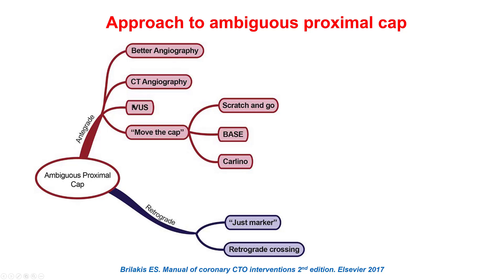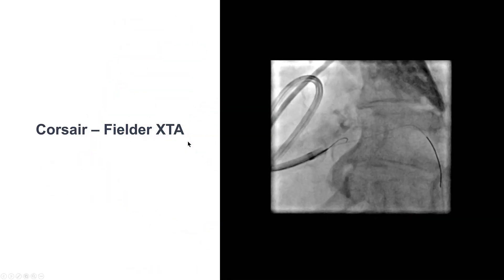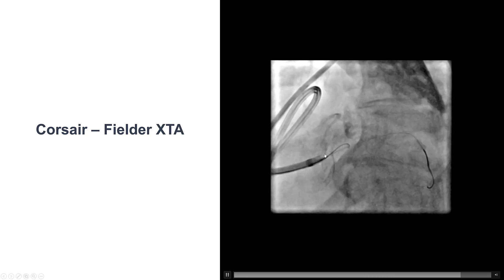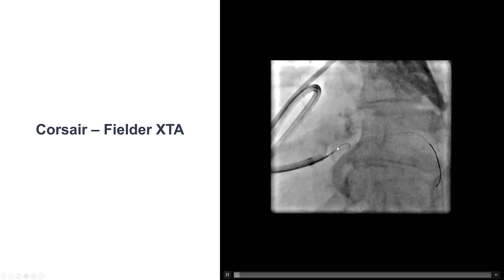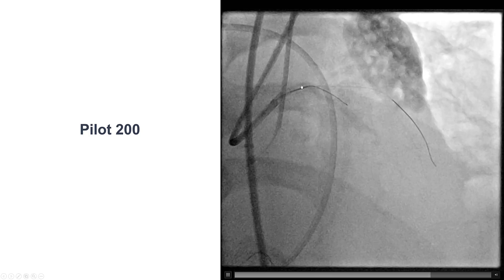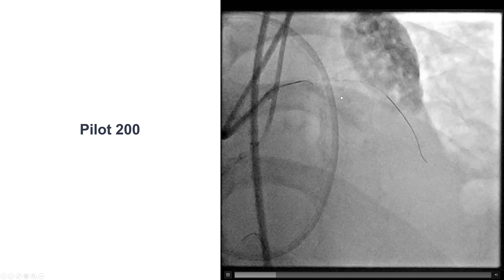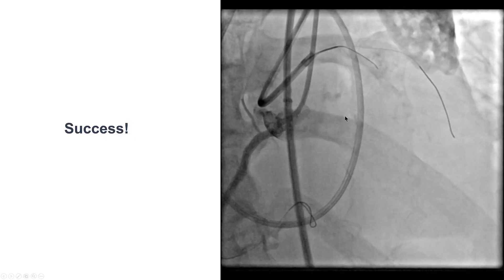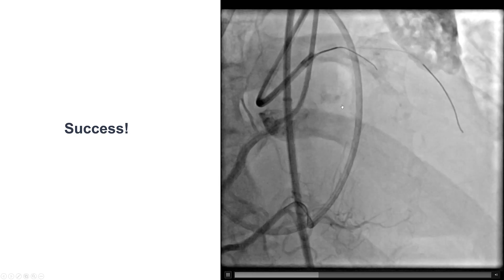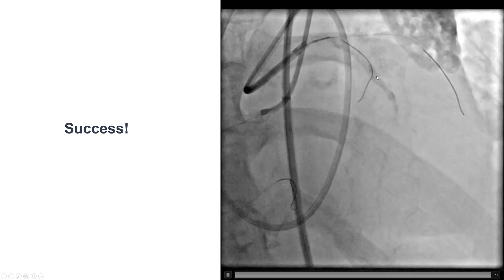We did not perform a CTA, but intravascular ultrasound supported the notion that the entry to the LAD CTO was at the area of the nub. Move-the-cap techniques were not an option because of the large circumflex branch — we did not want to cause a dissection compromising circumflex flow. In heavily calcific lesions, we avoided highly penetrating guidewires initially and tried first with a Fielder XTA, which kept prolapsing toward the circumflex. We then switched to a Pilot 200, which appeared to enter the nub. Advancing the Corsair, the Pilot 200 tracked along the vessel course based on wall calcification. The contralateral injection confirmed a true lumen position, verified by advancing the wire during injection, tracking it into the septal branch.